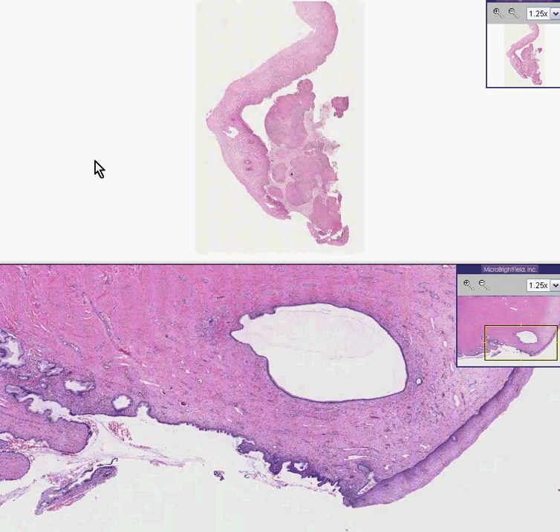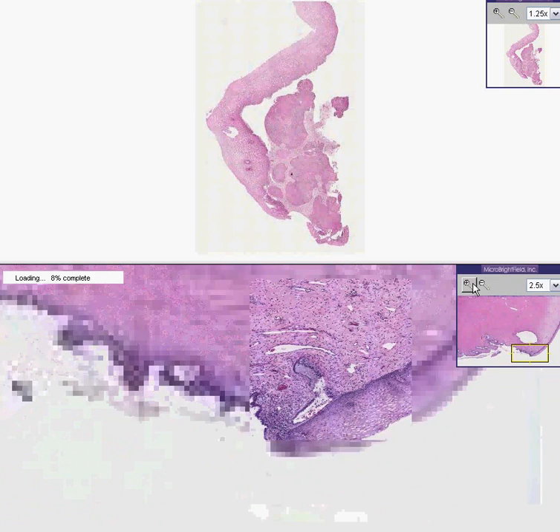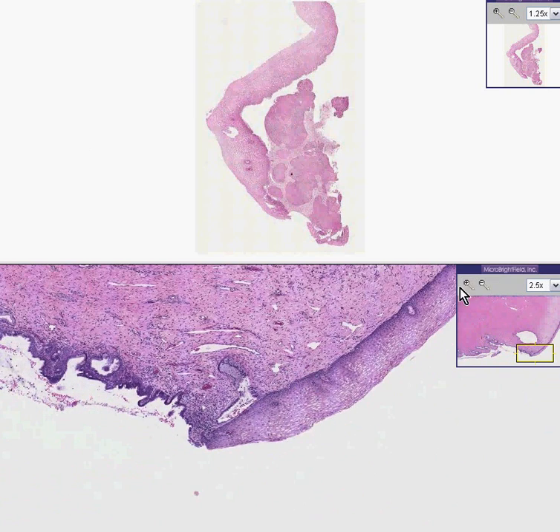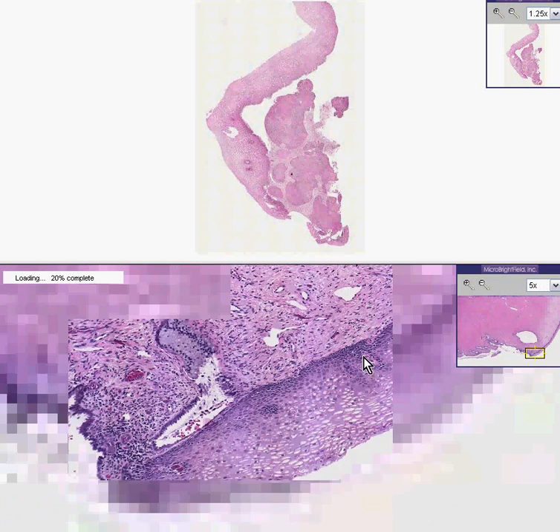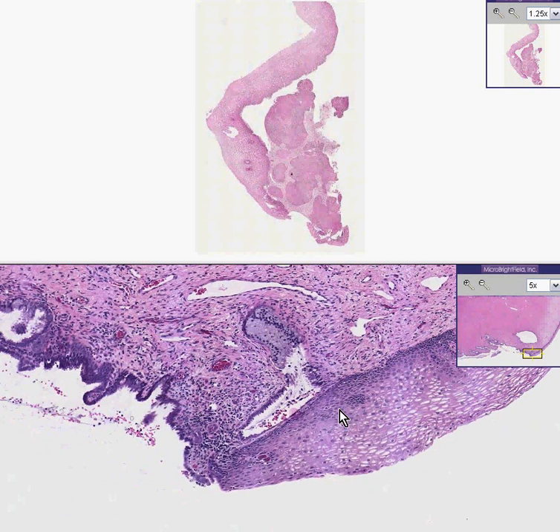We're taking a break from pap smears now and looking at some real tissue. On the bottom, we have some real normal tissue. You can see that there is a nice strip of squamous epithelium in the ectocervix in which you have good maturation from the basal layer to the thin superficial squamous layer.